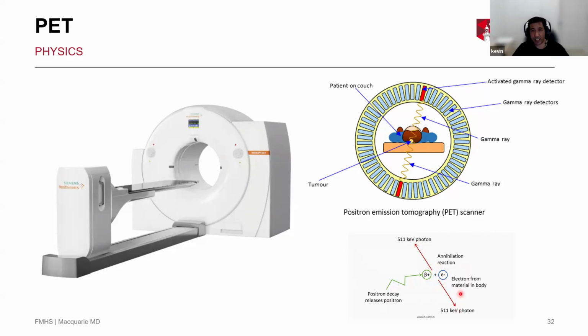Now, this is a really good thing to happen because the electronics in this machine is so amazingly fast that firstly, it can pick up when those two photons hit, which gives it 2 bits of extra information. One, it tells the machine the slight difference in timing, so it knows where or when each particle came from along the path between the detectors, okay? And this is called coincidence detection, okay? It is why PET scanning has a much, much better resolution than the single photon scanning, all right? And as a result, it can reconstruct an image.